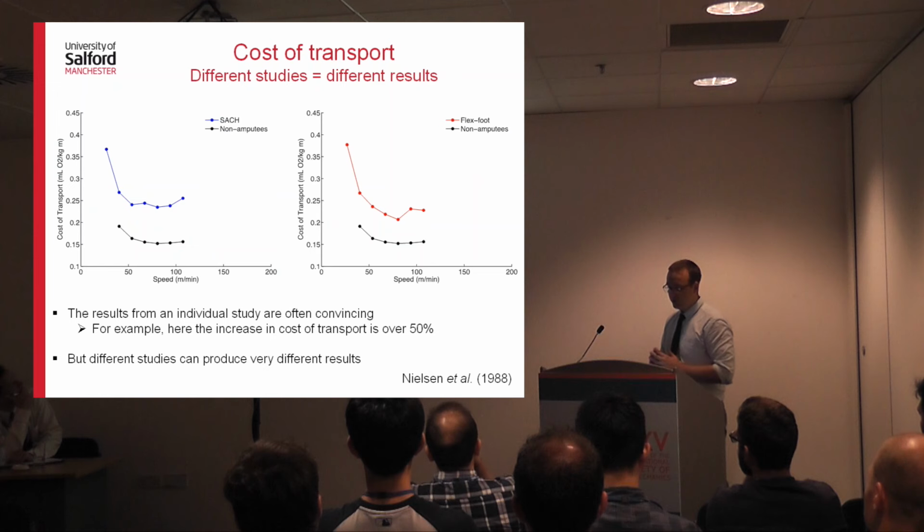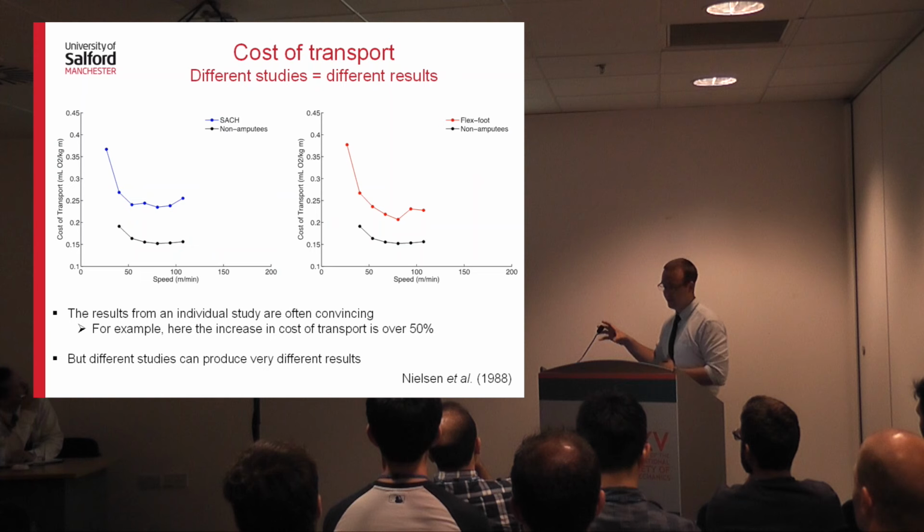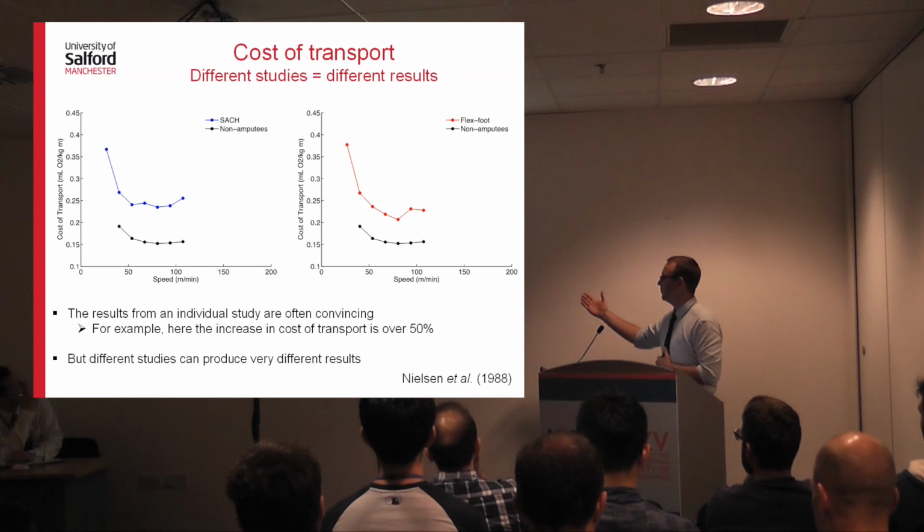What I want to show here is how if you take data from different studies and lump them together, you'll see that you get quite different results. So I've separated out here the SACH foot on the left and the flex foot on the right, and this is data from one study, the Nielsen study. And what you'll find is typically the cost of walking, like we're seeing the transtibial amputees, is higher than the non-amputees. In this case, around about 50% higher.